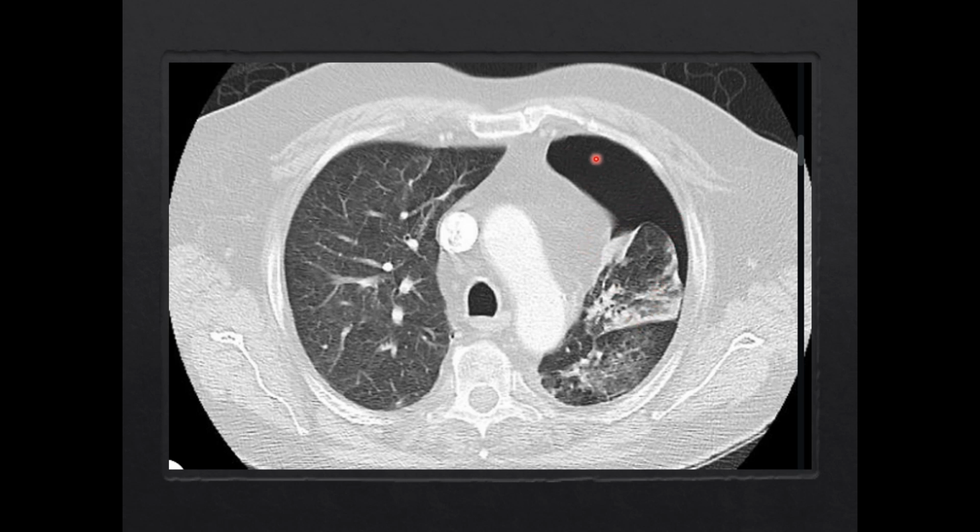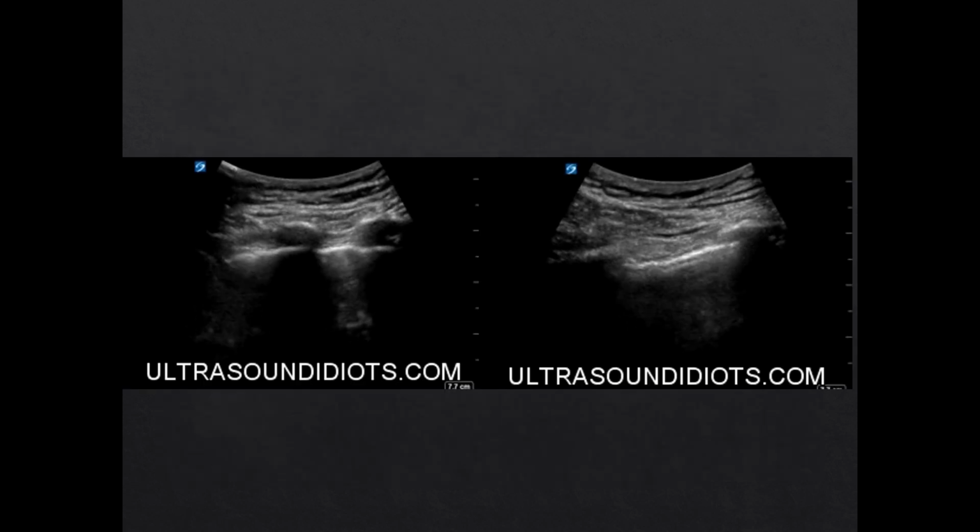Now, it's not always going to be this big. Sometimes you see a thin pneumothorax, but it is much easier to see on this kind of image. This is the ultrasound view of the lung. It's done often in EFAST, and it can be challenging at first to know what you're looking for with a pneumothorax, but once you know what you're looking for, it's actually quite simple.